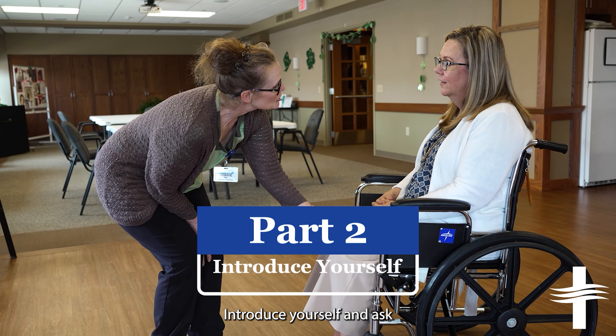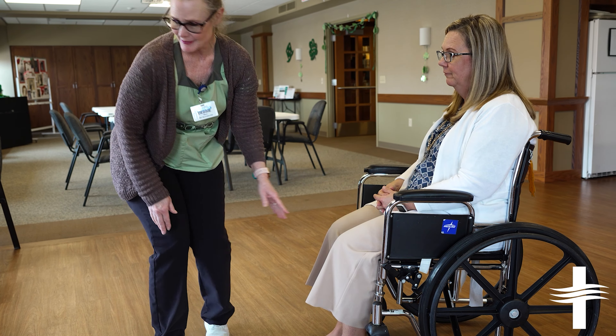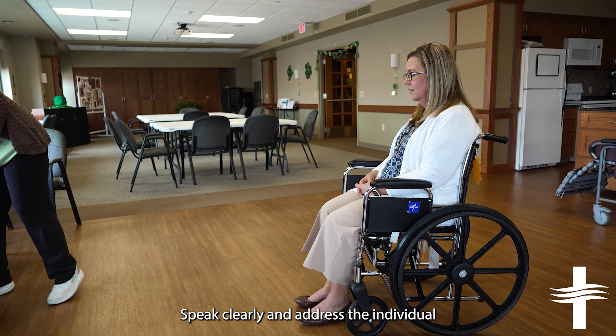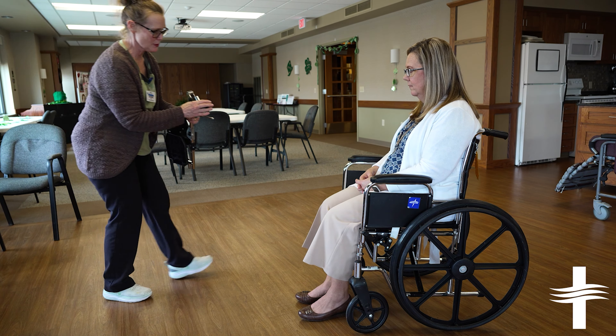Introduce yourself and ask if they would like to go to the area or activity. Speak clearly and address the individual from the front at eye level whenever possible. Residents have the right to choose what they wish to attend. Please be encouraging and explain why they may enjoy attending that particular activity.